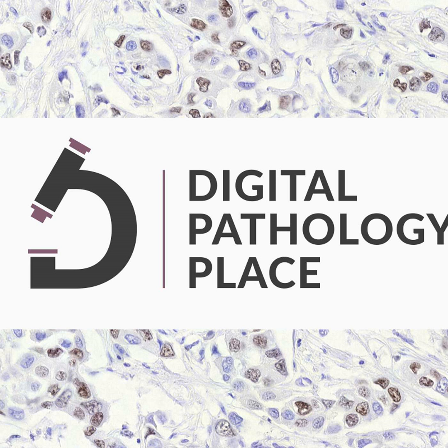And you've probably heard me sound like a broken record, but maybe somebody is here for the first time. So me visually guesstimating the percentage of cells that were positive for PD-L1 in the tumor, and then me, with the team, developing a quantification tool that was not based on single cells but on area of tumor. And then we were comparing these to each other, and me guesstimating was the ground truth. Now we have better sources of ground truth, and we should look for better sources than pathologist guesstimation.